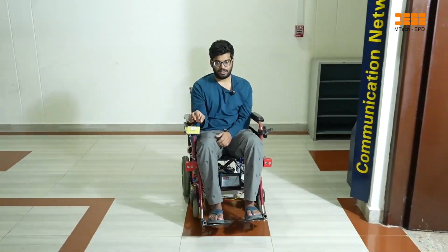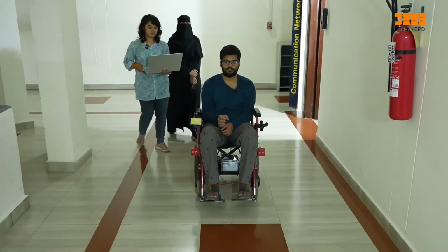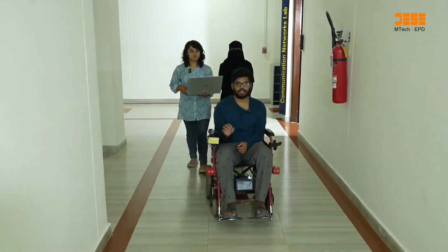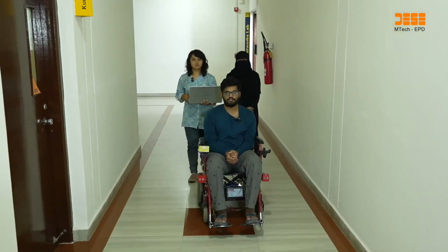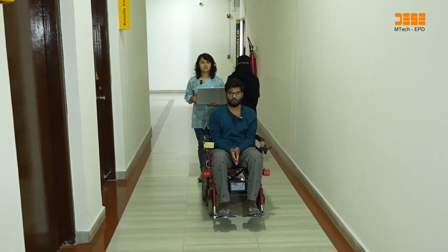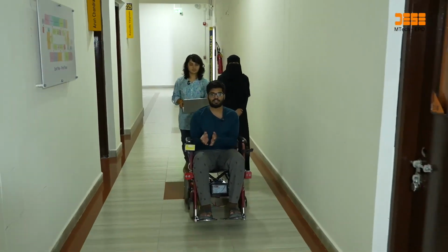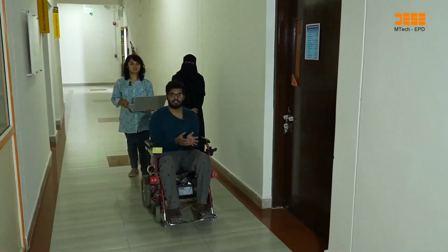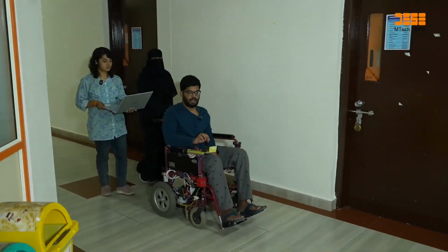So as you can see, initially, our steady state speed is 5 km per hour, and that is converted to 40 RPM. So it took 2.5 seconds to settle to 5 km per hour, and you can see I'm moving straight. That means that both the motors, left motors and right motors, are synchronized properly, and both are moving at the same speed. Now I am going to turn right.